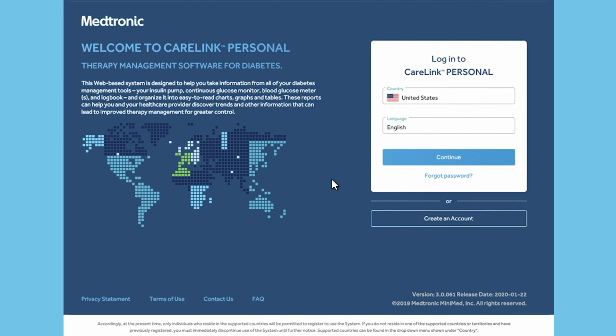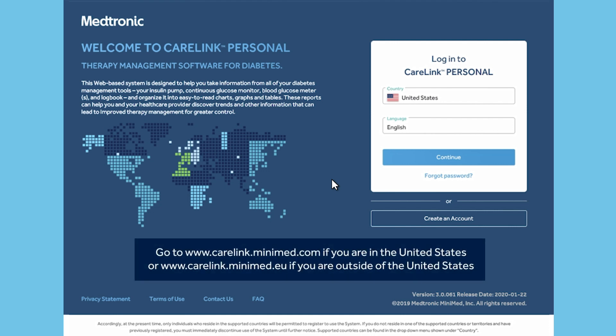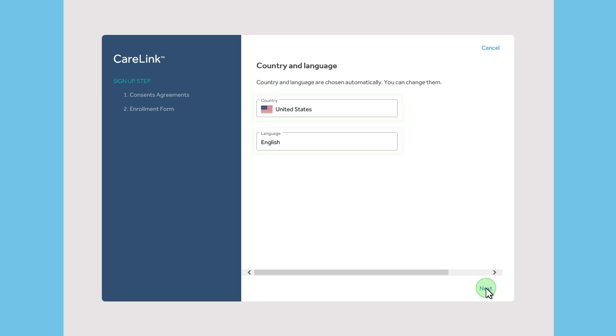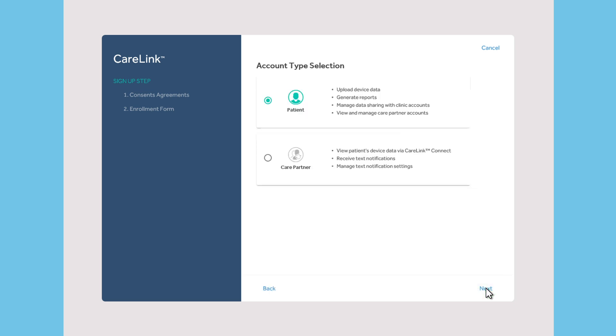If you have not yet created an account, go to the Medtronic Diabetes CareLink personal website and select Create an Account. First, select your country and language. Then choose Patient as your account type.